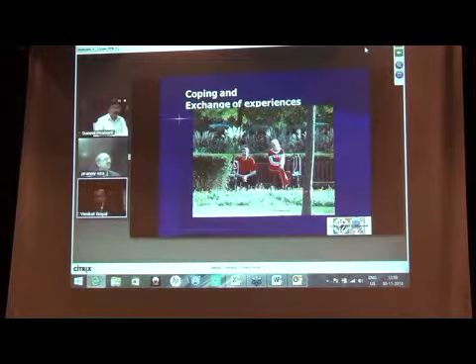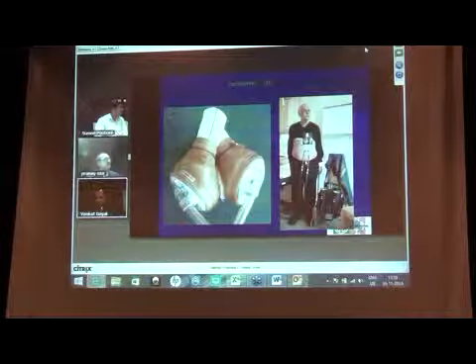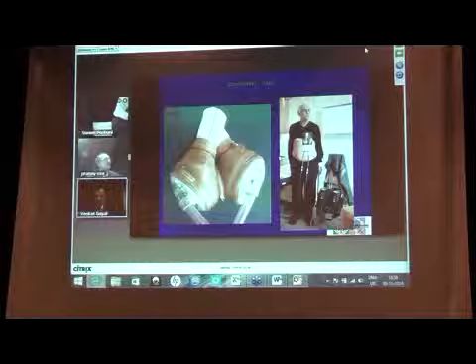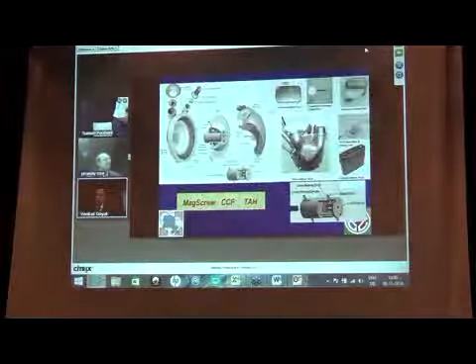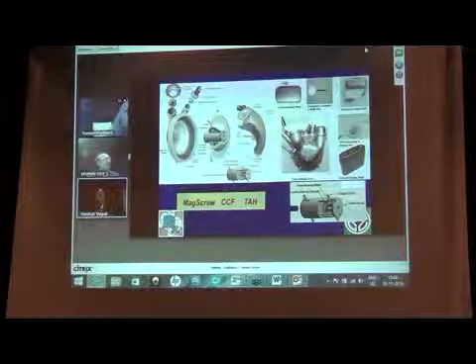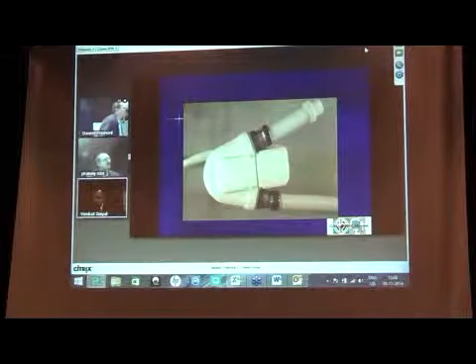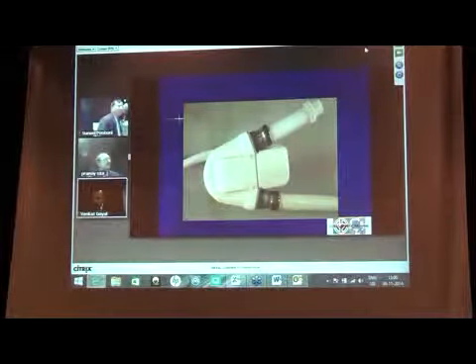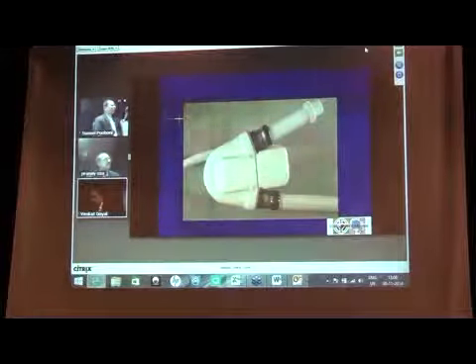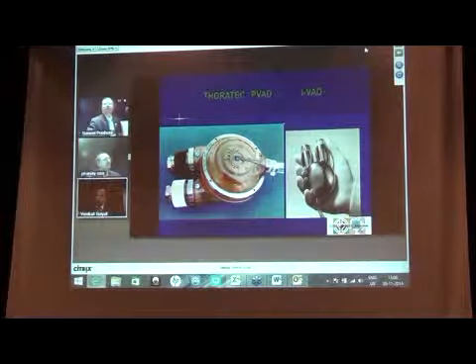Then came, this was a biventricular device, a total artificial heart, two pumps going to the chest wall. This was the size of the device, which was intrathoracic. Then came the era of the electrical system. In the electrical system, this was a compact thing. As the automobile industry is at the full heights of excellence, perfecting a cardiac or blood chamber and a blood pump was not very difficult for them. They kept on improving things. Now the cardiac pump reduced to the size of the palm. So this is how things have progressed, somewhere in 1995.